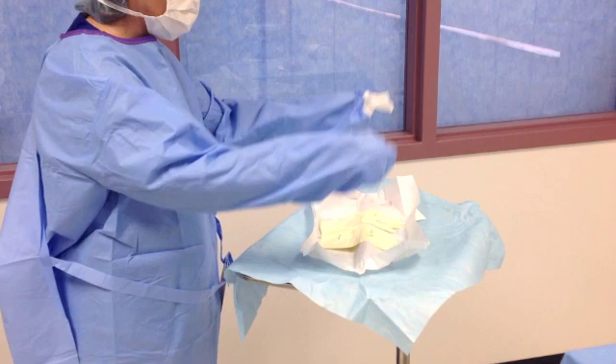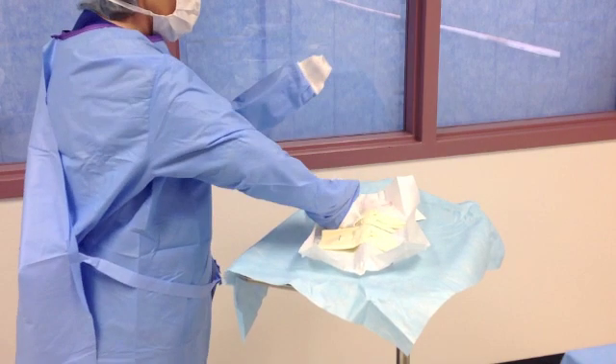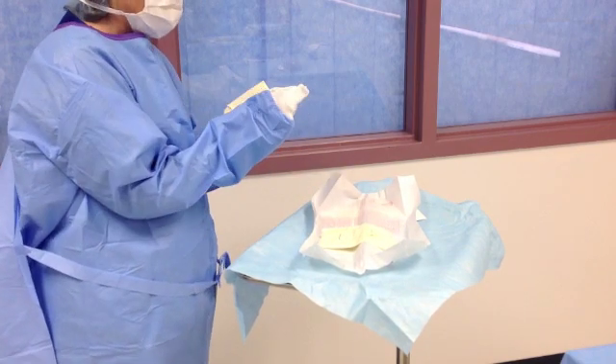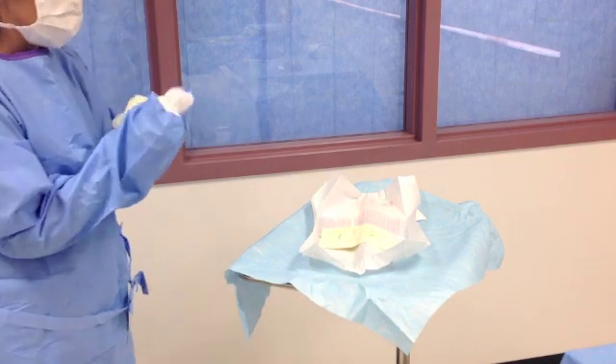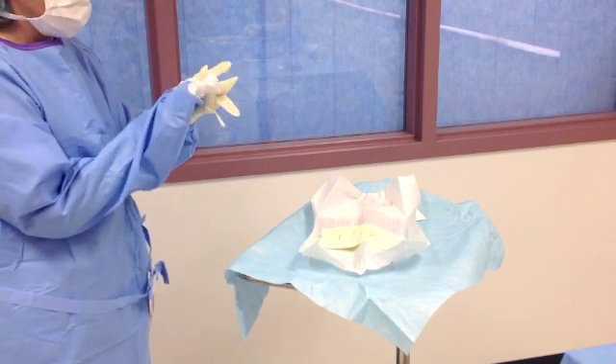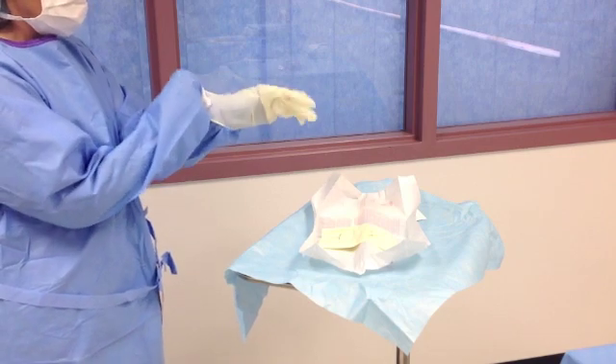Keeping your arms out in front with elbows bent, grasp the cuff of your left glove with your right cuffed hand. Lay the glove thumb side down with your fingers pointed towards the elbow. Take a step back. Grasp the bottom side of the cuff with your fingers of the hand being gloved, making sure your fingers stay within the cuff.